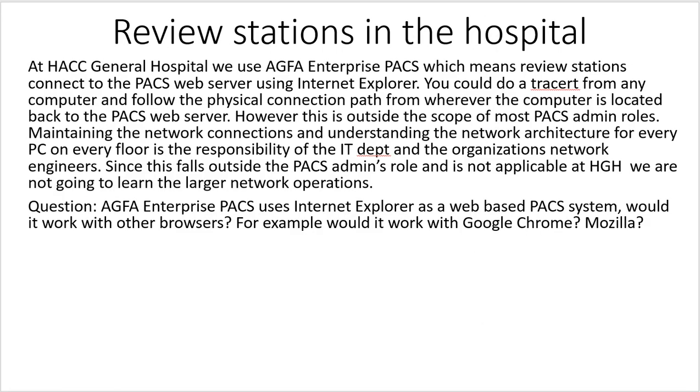So if a PC can't connect to the network and it can't pull the information it needs, it's really an IT problem. We're not going to get too involved. If it doesn't pull up images, we'll probably get the call from the ER department, but we'll immediately turn them over to IT to solve their network connection problem.